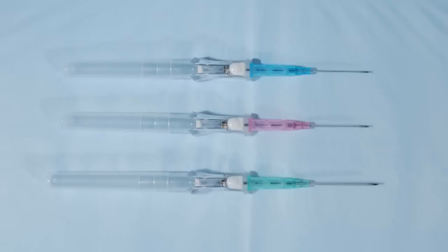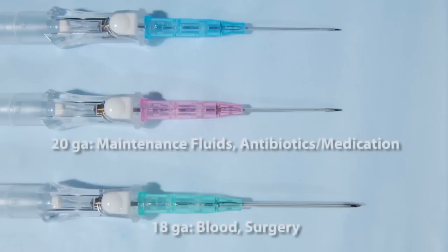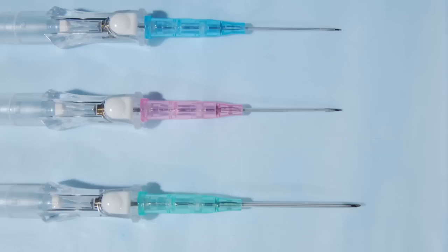Angios are numbered based on diameter. The higher the number, the smaller the diameter. They are also color-coded based on size. Most often, a 20-gauge angiocath is chosen if the patient is receiving maintenance fluids or antibiotics and medication. If the patient is going to receive blood or go to surgery, an 18-gauge angiocath is required.